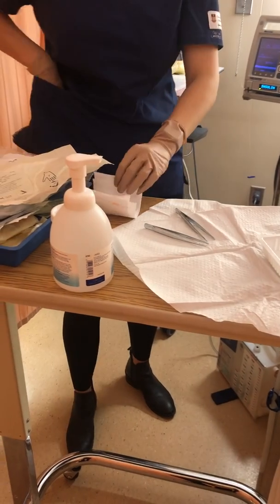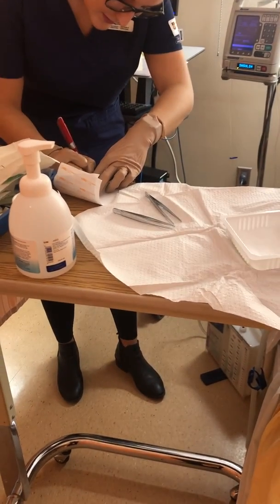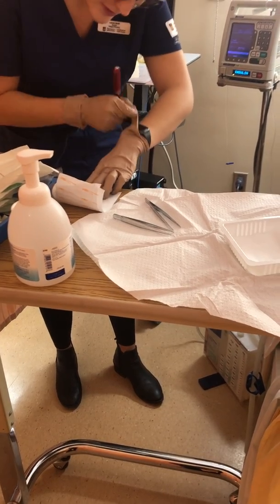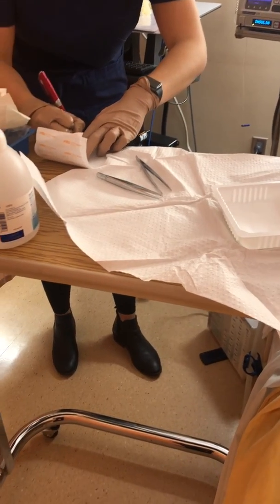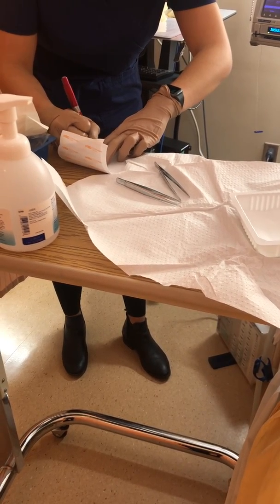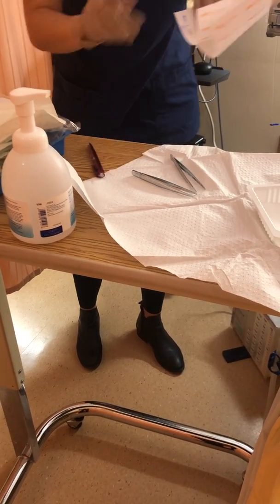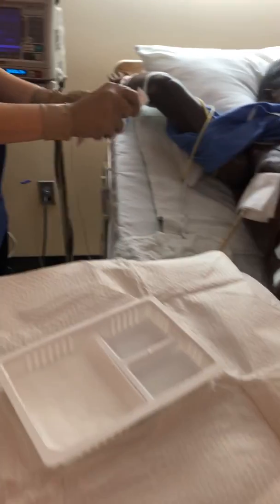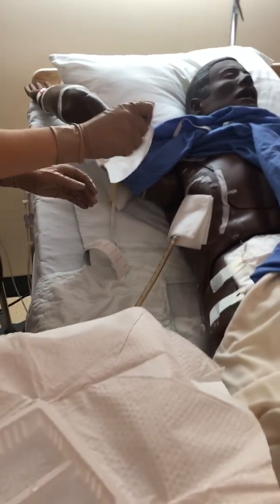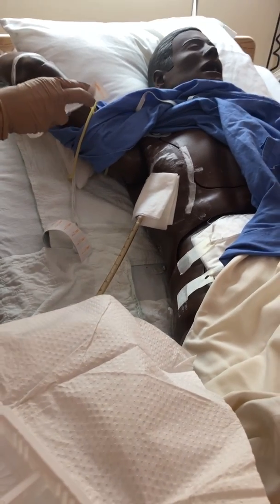So I'm going to take my Kenfix here, and I want to write the date and time. So today's date is November 8th, and it is 1100. I'm going to sign with my designation on here. So I'm going to start by doing the top part of the dressing here.